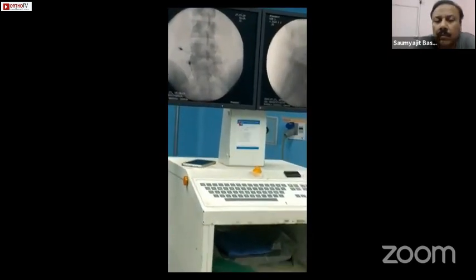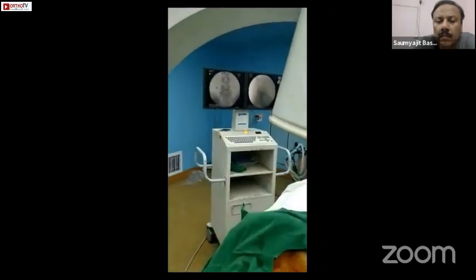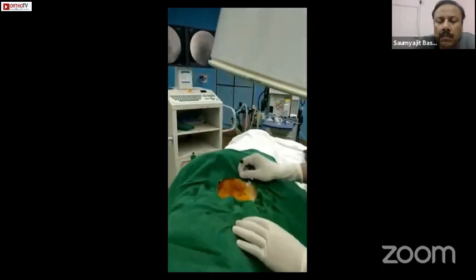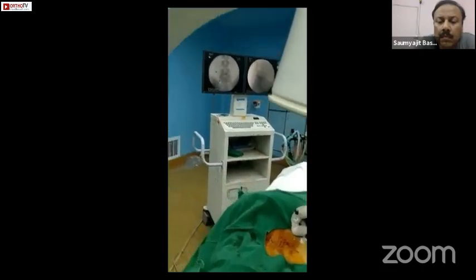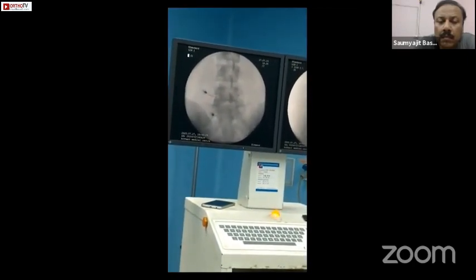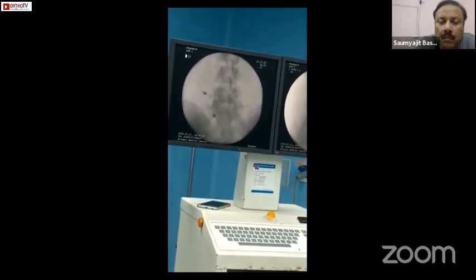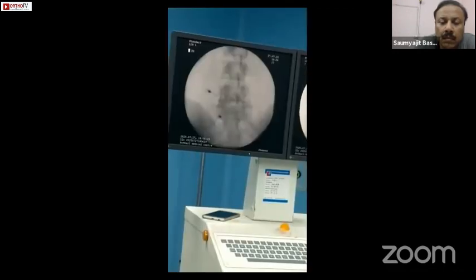I need to direct it and close. Now I see I can get the loss of resistance and it goes down. Now I take a shot and you see I am dot on the posterior foramen. It has gone down, as you can check by the amount of needle which is protruding out.